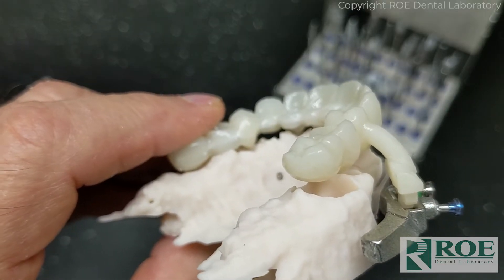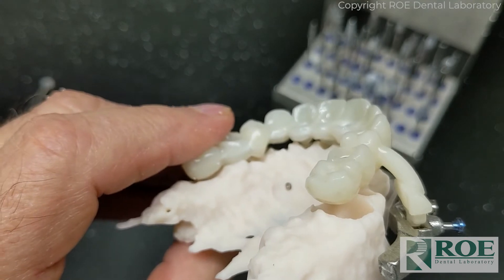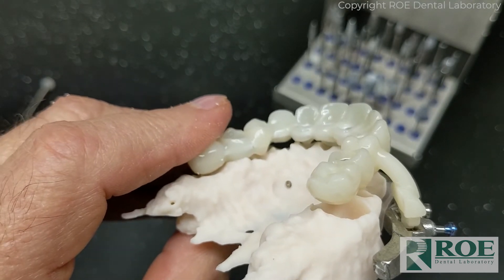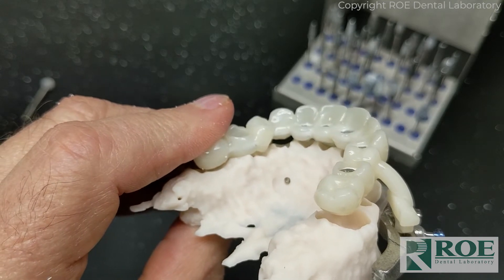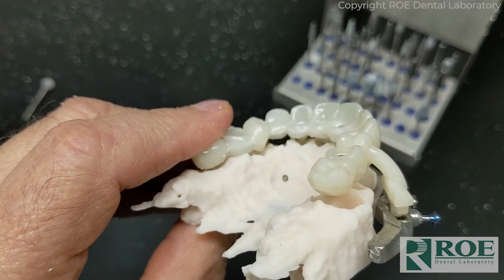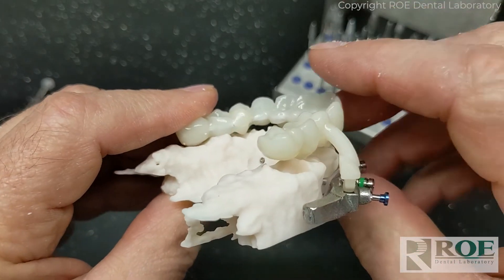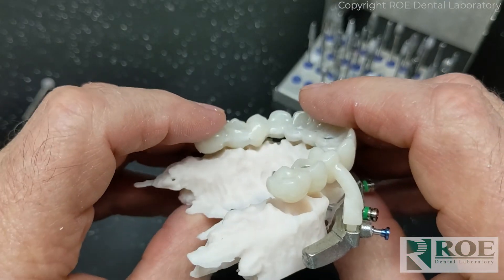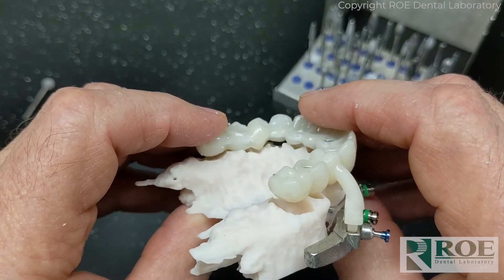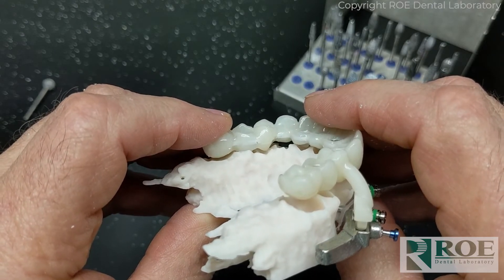I have relieved the pontic section and also the socketed area in the first premolar, and that is free. But what we have to look at now is a pontic section here that is still hitting — you can see the pivot right under this tooth — so I'm going to make an ovate area in that site.